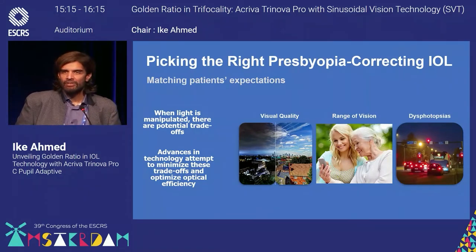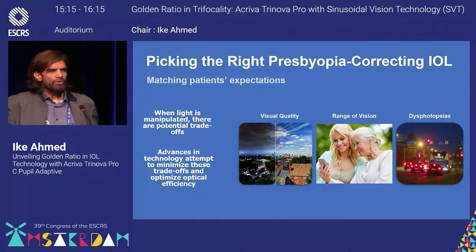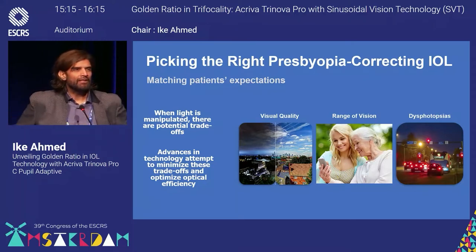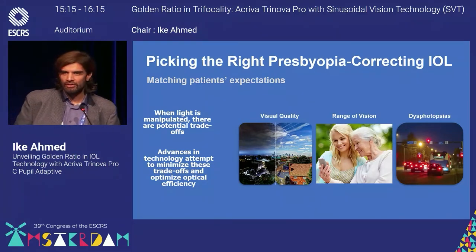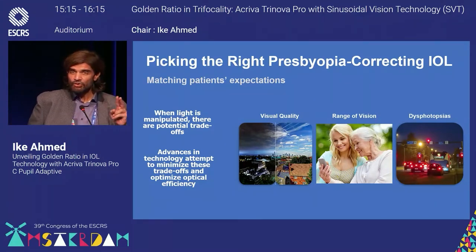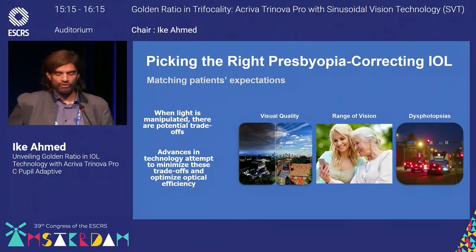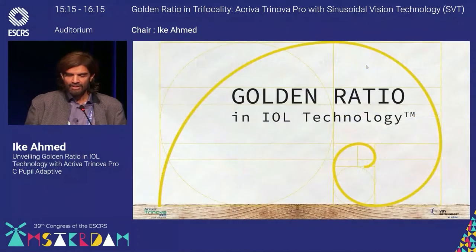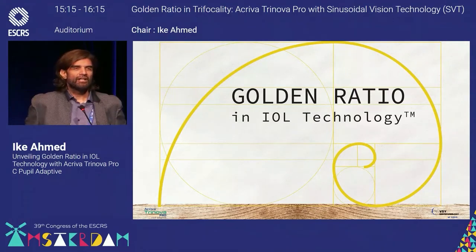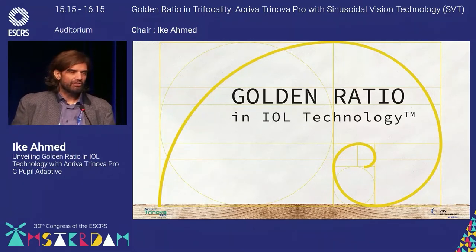There's always a balance in picking the right presbyopic correcting lens and meeting patient expectations. It seems like we're always trying to balance out the increased range of vision, but what happens when we manipulate light, potentially we have some risks, and those risks include contrast sensitivity loss and halos and glare. And for these two reasons alone, many of us have been reluctant to really offer these technologies for a wide range of patients. Well, of course, we're all looking for that masterpiece. We're looking for that perfect arrangement of technology to really address and balance these needs. And I think we have some better answers today, and I'm going to share with you.